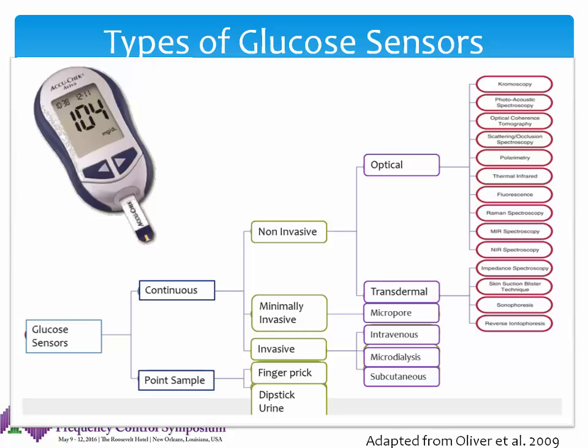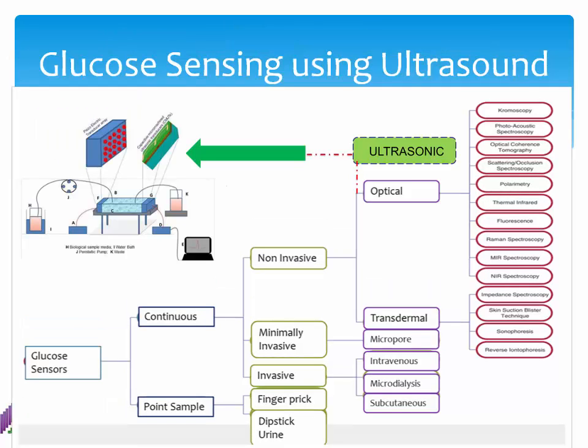and are quite cumbersome for whoever is using them. There's a good likelihood that at least some of us in the room know somebody who's a diabetic and knows the issues with using these sorts of devices for regular monitoring. So the ability to potentially non-invasively and remotely probe for glucose concentrations might be of interest, or at least to be able to do it with very low sample volumes in a microfluidic device, and in a continuous reading format.